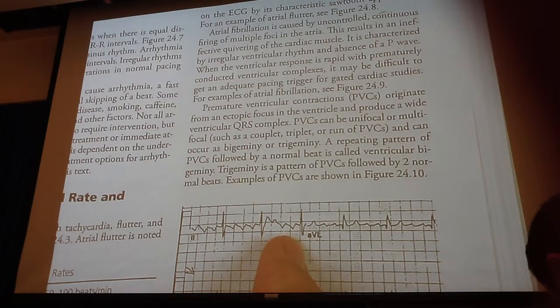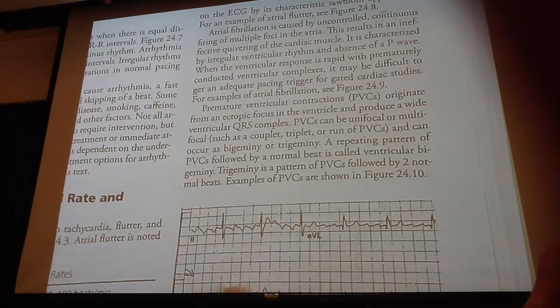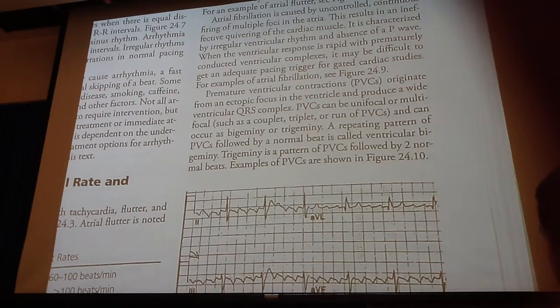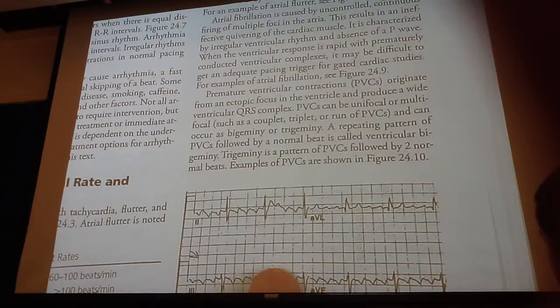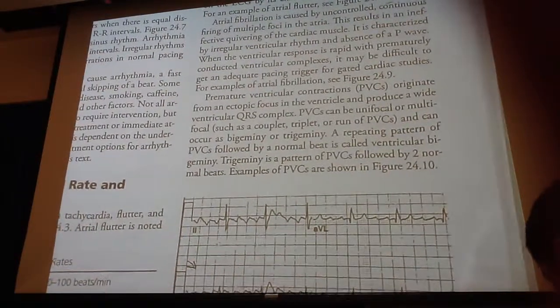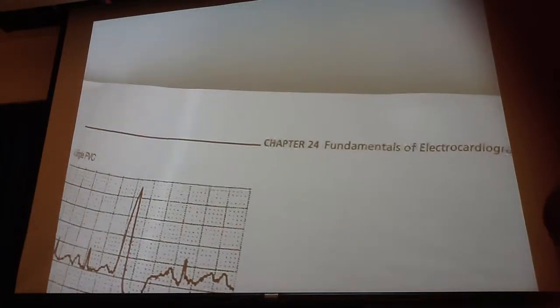Is that also with the stemming? I'm sorry, is that also with the stemming? The third one? Which one? No. But this is important because this can create defects on your scans. Okay, let's take a look over here.